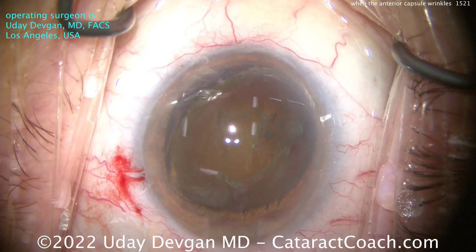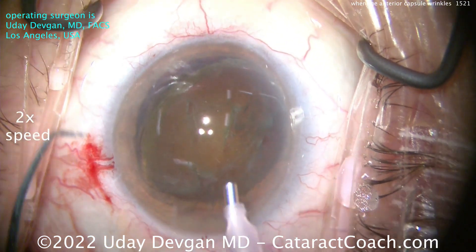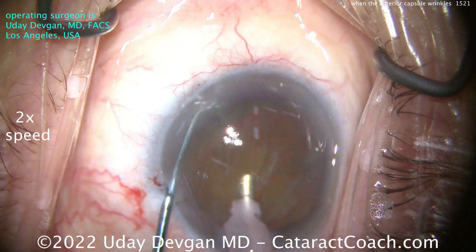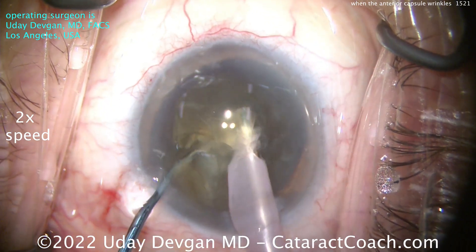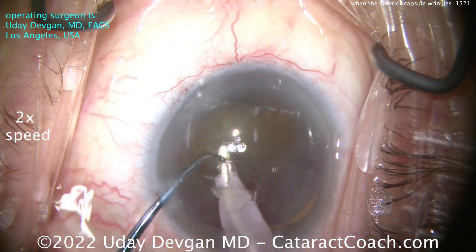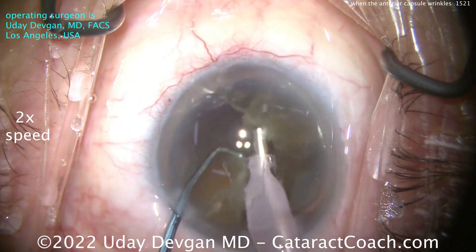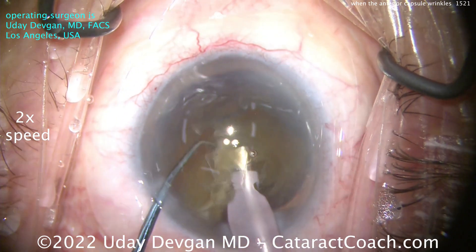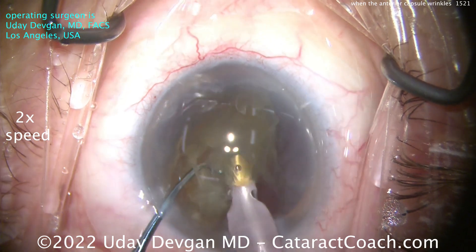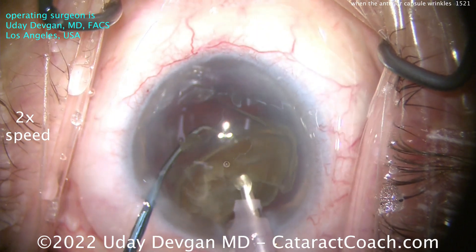Why is this easier? Because I'm not going to put any stress on the capsule bag. A little more viscoelastic going inside there to protect the central corneal endothelium — just a small aliquot, not a huge volume. Going with a phaco probe, the first thing I want to do is get that chopper behind the nucleus, trap it, and chop it. Now that I have two halves, I can emulsify the first half — there's really minimal if any stress on the capsule bag, because we've tilted the lens out of the bag and we're operating in that supracapsular space around the plane of the iris.